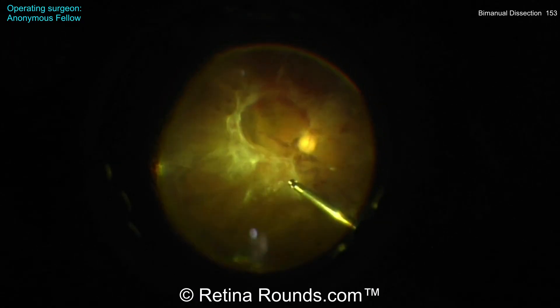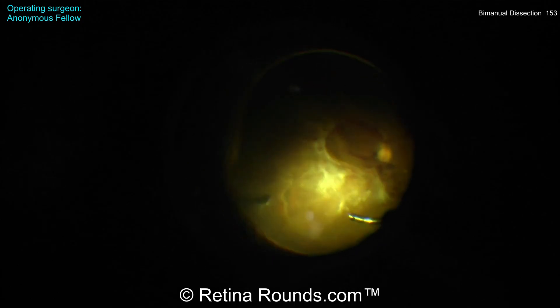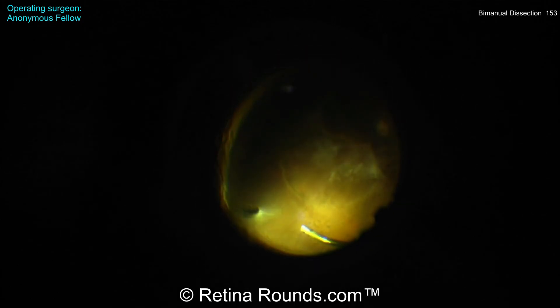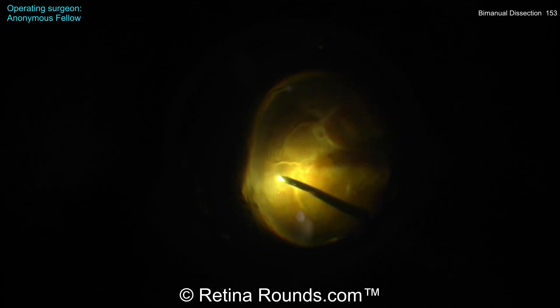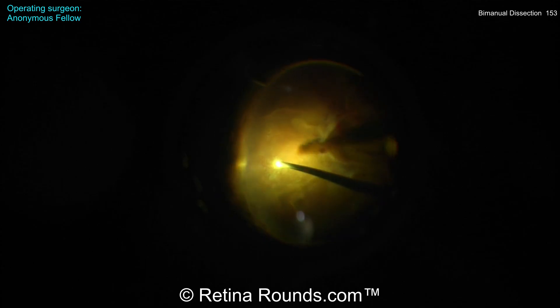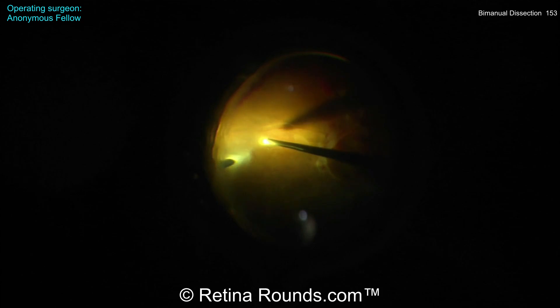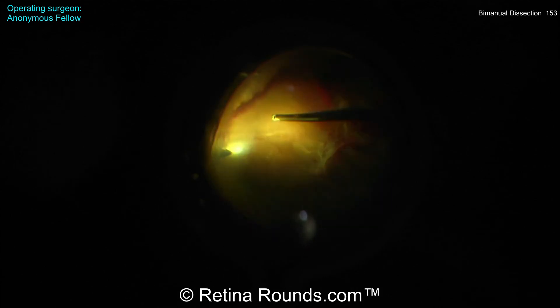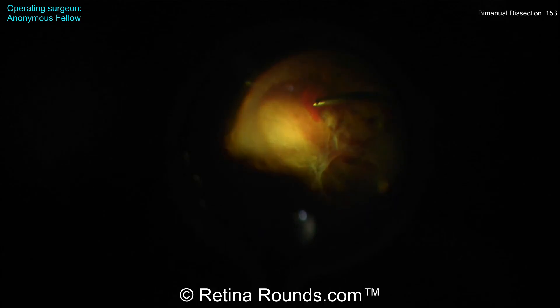This patient has advanced proliferative diabetic retinopathy with a wolf jaw configuration of fibrovascular proliferation around the arcades and then connecting in the temporal macula. The surgeon is starting by performing a core vitrectomy and is now segmenting the anterior and posterior vitreous 360 degrees. The purpose of this is to get access to and identify the correct surgical plane.